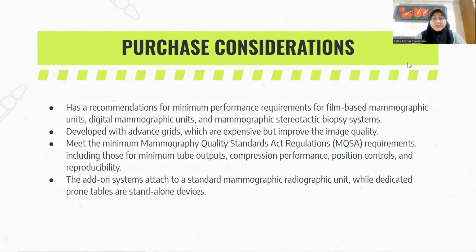The purchase considerations of mammography are recommendations for minimum performance requirements for film-based mammographic units, digital mammographic units, and mammography stereotactic biopsy systems.